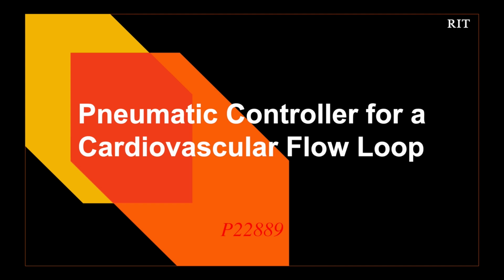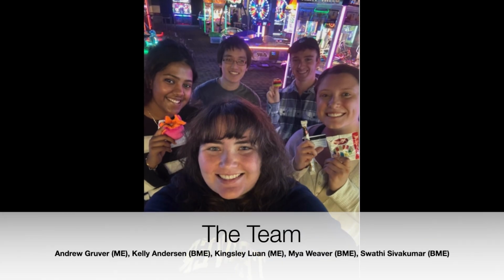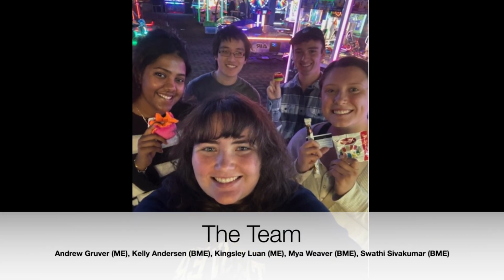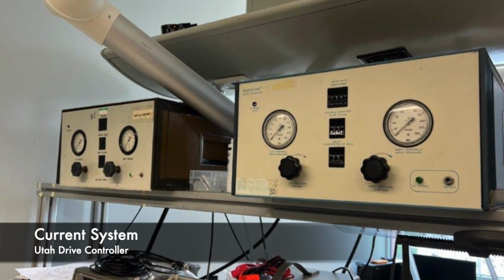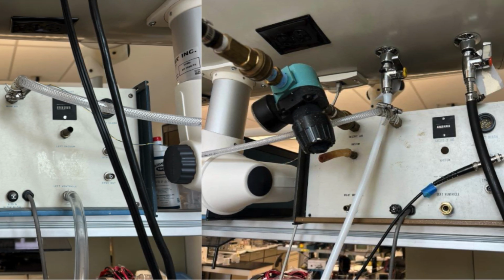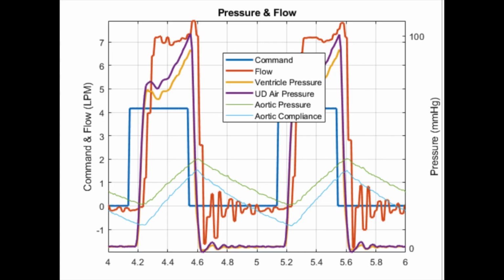Hello everyone and welcome to the Pneumatic controller for our cardiovascular flow loop. Our team of 5 engineering students is helping Dr. Kaloji with this project. Currently, the main problem that we're facing is that the old system is at risk of breaking due to its age and cannot create the proper waveforms for a heartbeat.